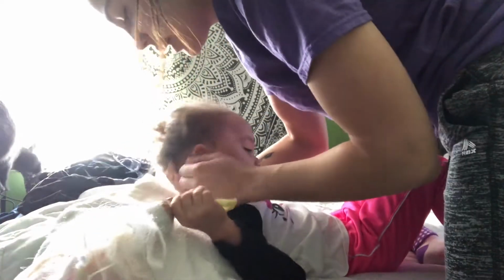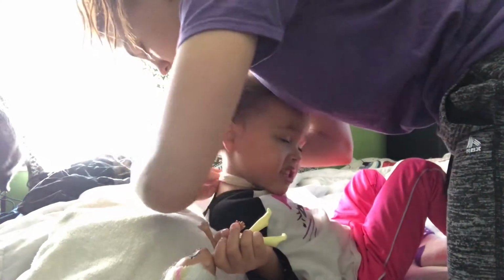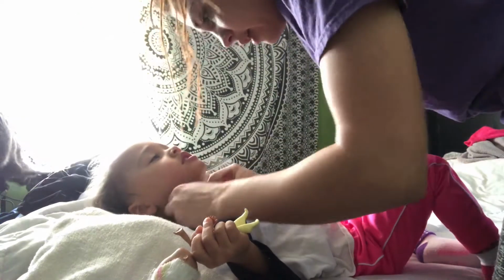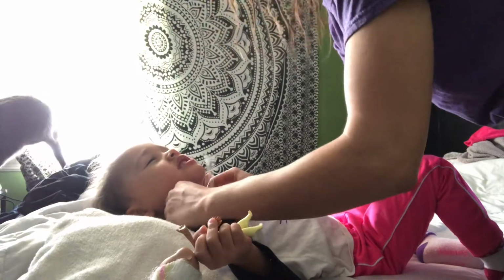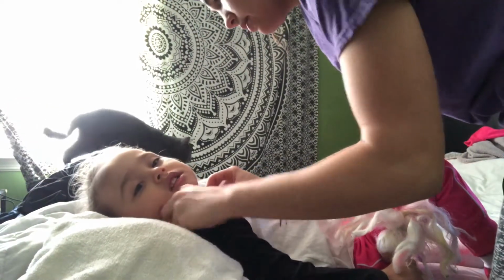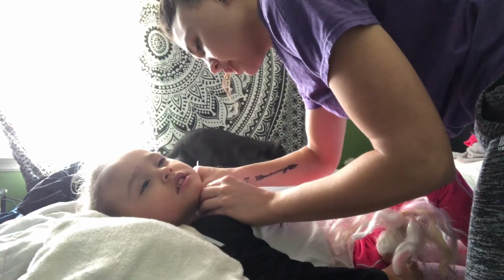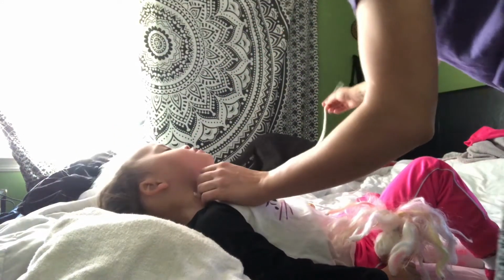So I put her hair up in a little bun, just so it's out of the way. We're going to take her old trache ties off first. Why don't we put your hands down, baby, so they can see. She just got out of the bath, so these trache ties are a little damp. I try not to get them wet so much.